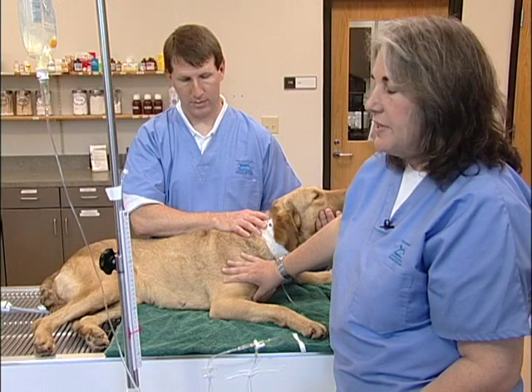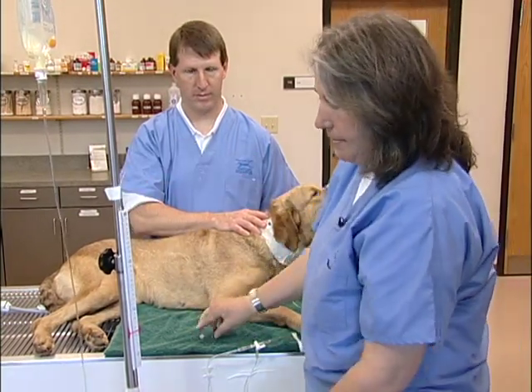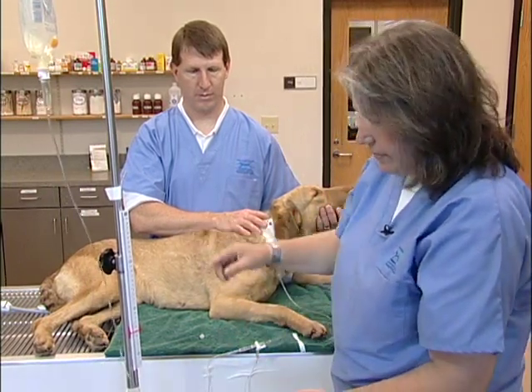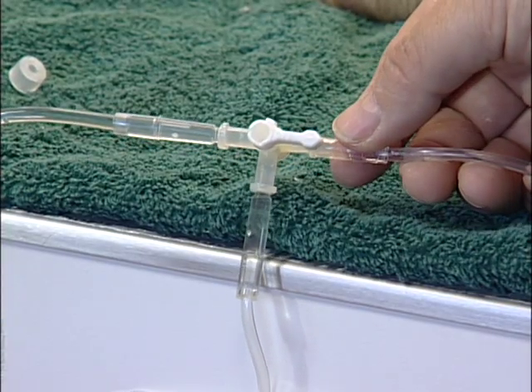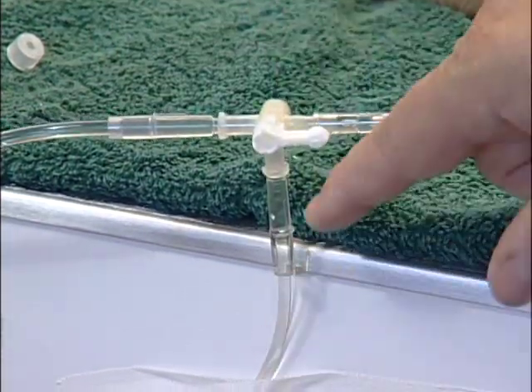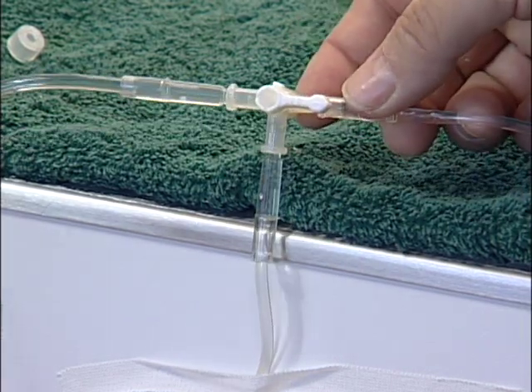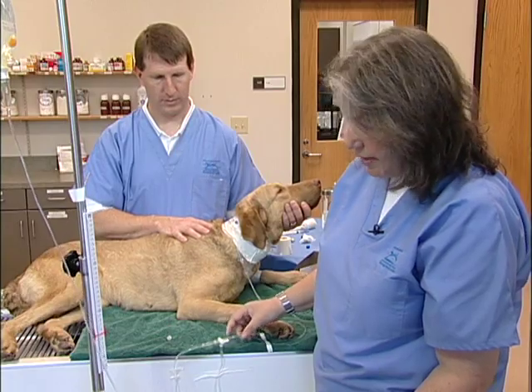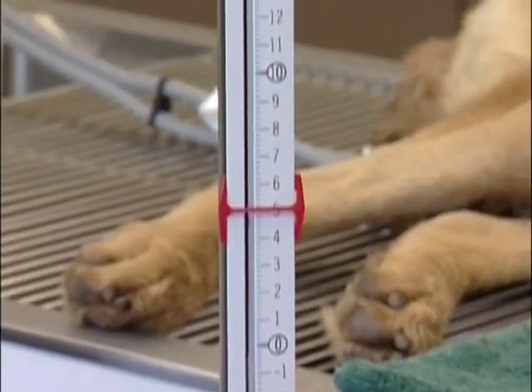Now I can go ahead and take that CVP reading. First I'll remove the little cap from the top of that manometer, and then I'll use my fluid bag to actually fill the manometer to the top. I have everything connected to a three-way stopcock — the manometer is connected here, my fluid bag is connected here, and the final piece is connected to the dog's jugular catheter. I'm going to begin by shutting the stopcock off to the dog, and when I open the fluid bag, the manometer will fill all the way to the top with fluid.